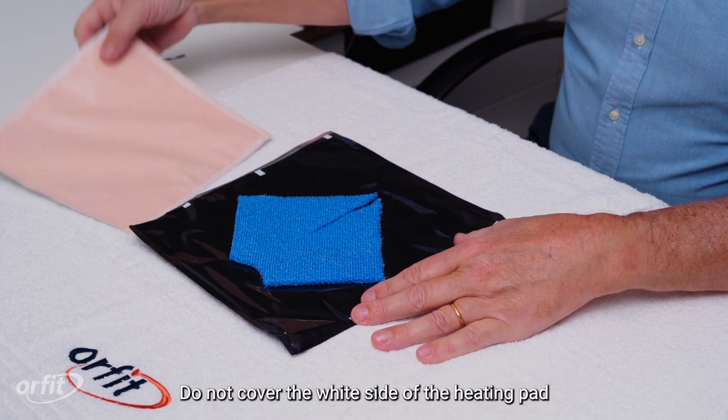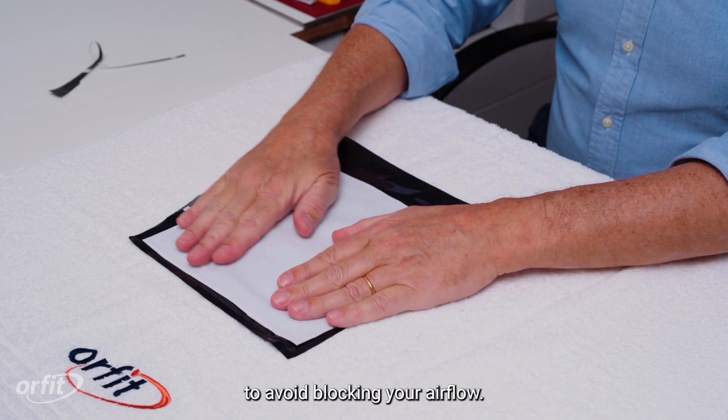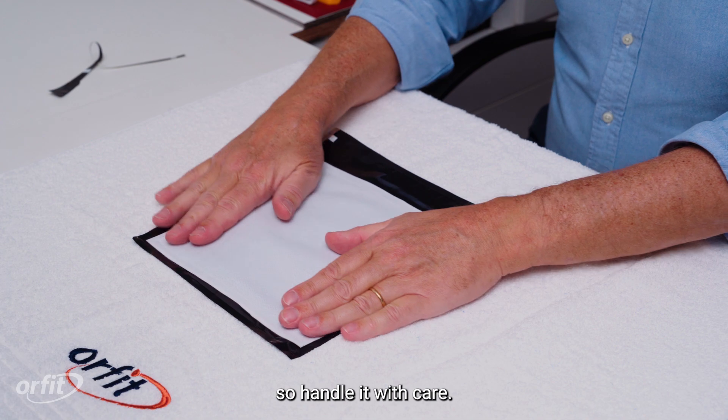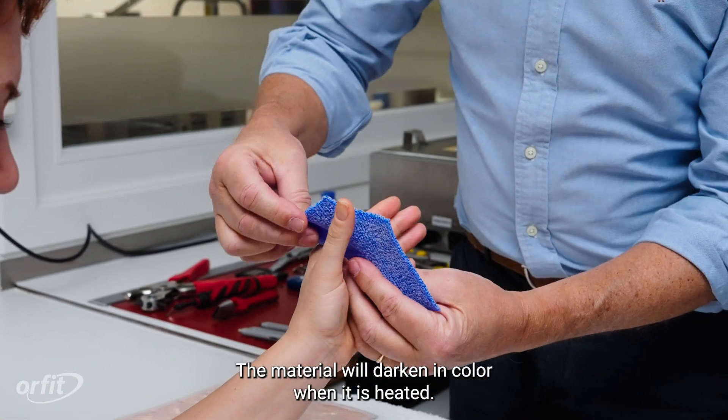Do not cover the white side of the heating pad to avoid blocking airflow. The heating pad will be hot, so handle it with care. The material will darken in color when it is heated.